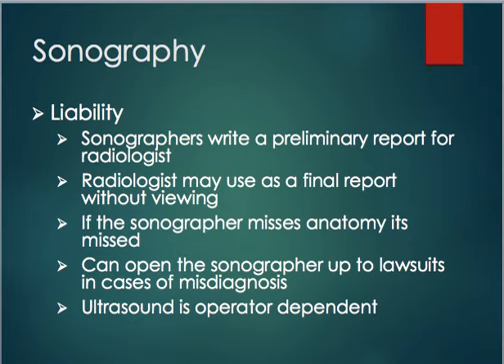But the problem is that if a sonographer misses the anatomy, it's missed. You can't get it back, right? Because you're scanning and recording. If you didn't visualize something in that scan, it's missed. That's the difference between radiology and sonography: in radiology, we take an image and include all the anatomy in that image. So if something's missed, that's on the radiologist because we included it in the image, so it's there.